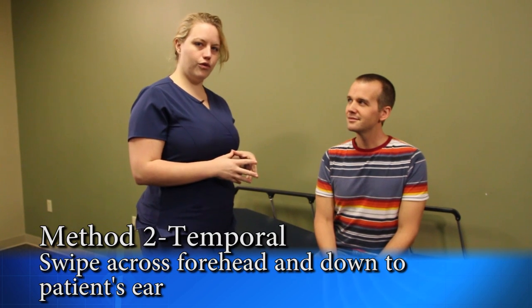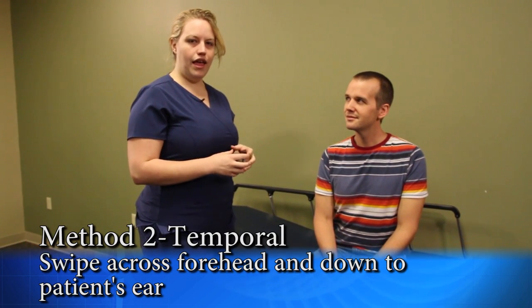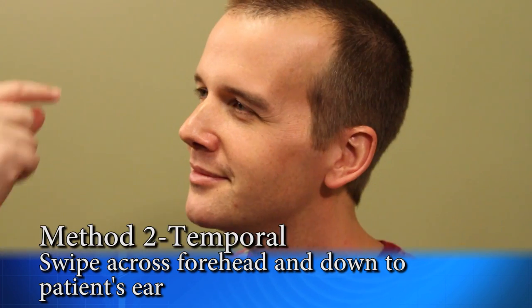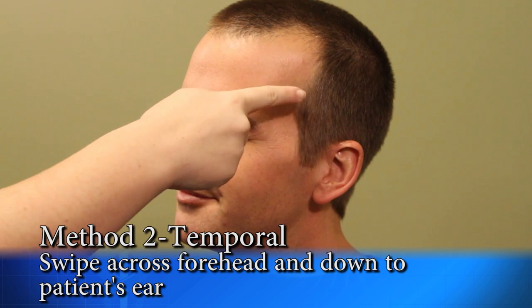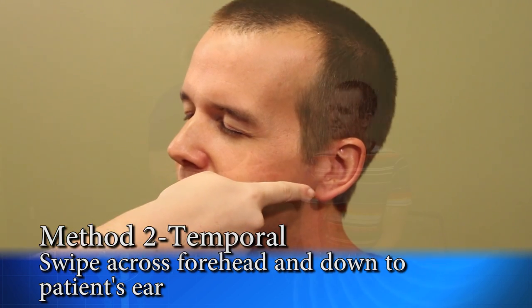Temporal is what you will see most often in emergency rooms and ICUs, where we'll start on the forehead and just swipe across and swipe down to the ear.